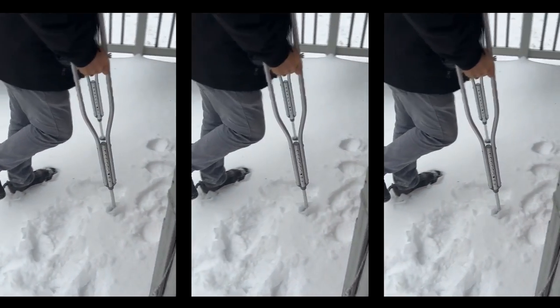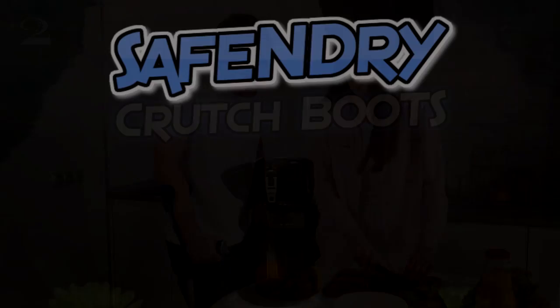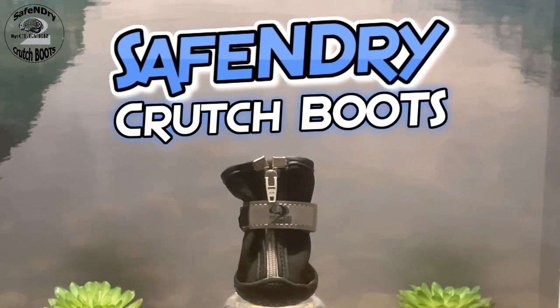Ever found yourself battling the elements, uncertain with every step you take on your crutches? Introducing Safe and Dry Crutch Boots — a game-changer in crutch safety.